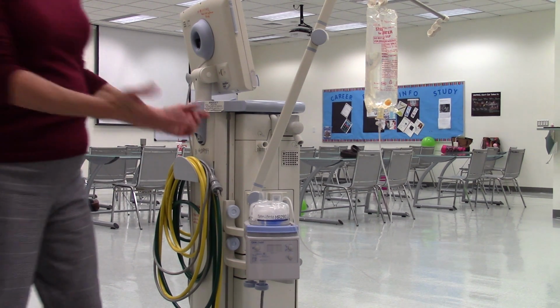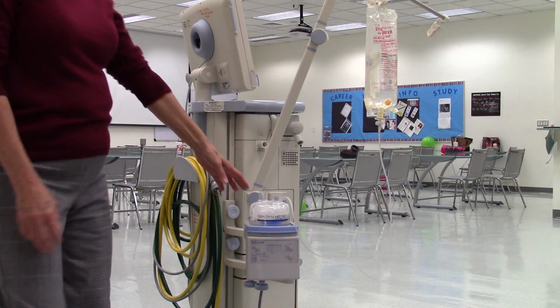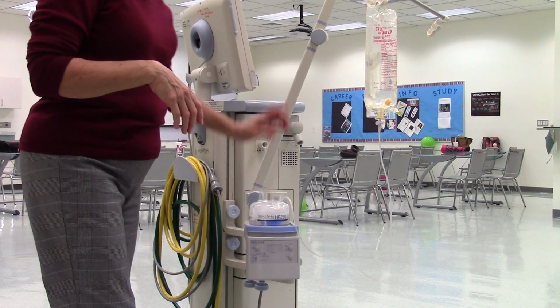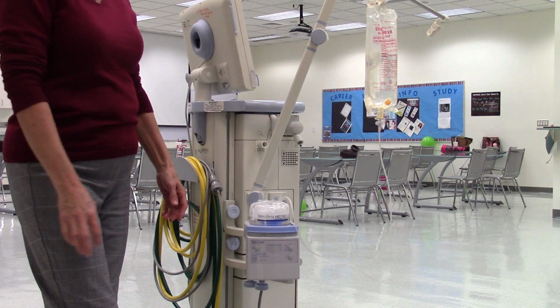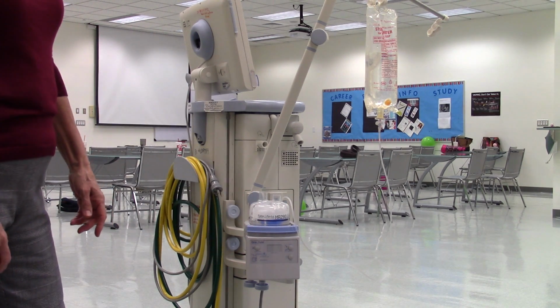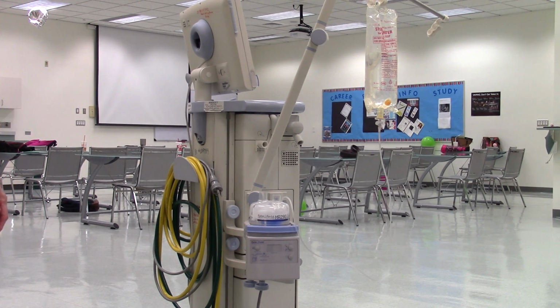Yeah, so if you see the water level go above the fill line, then this is damaged. And take it off, throw it out, and put another one in there. Because if it goes above the fill line, it'll keep filling, and it can get inside the ventilator and cause a lot of damage to the ventilator. Those are expensive. So you should never see water above this black line. Okay. But it shouldn't be lower than that line either? Lower is okay.